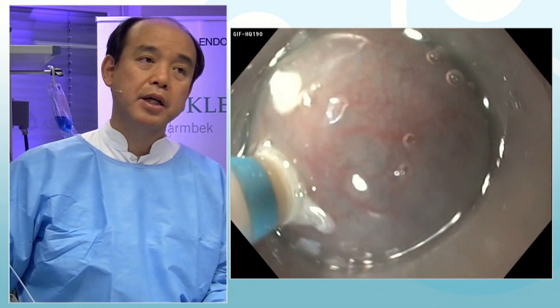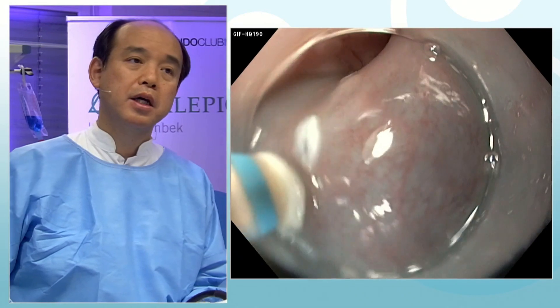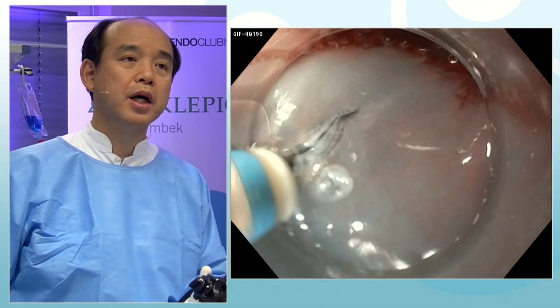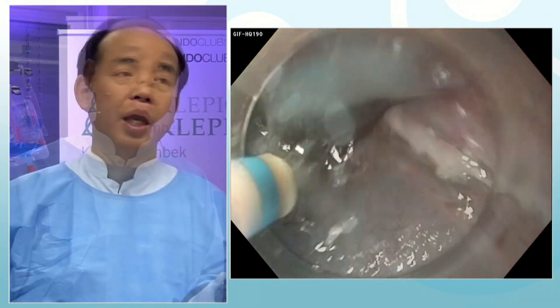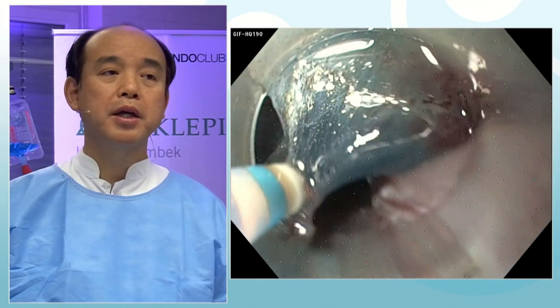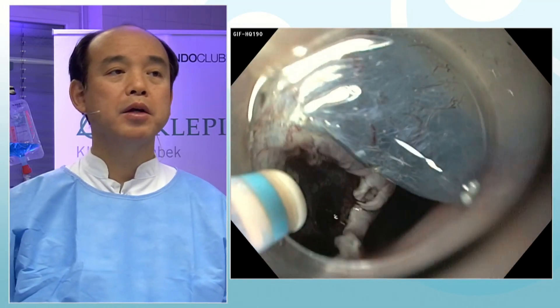Gently touch to the target tissue and start mucosal incision using Blend Cut — it usually cuts very smoothly. This is very similar to the dry cut mode of the ERBE VIO 300. Avoid touching the muscle layer. I can easily dissect the submucosal tissue just by rotating my wrist to the safe side. It's very easy, and this is almost the end of my procedure.